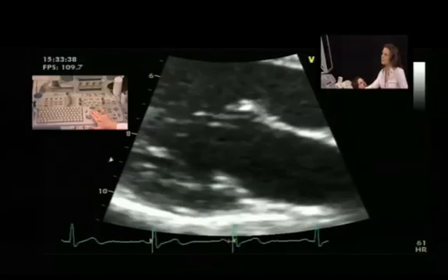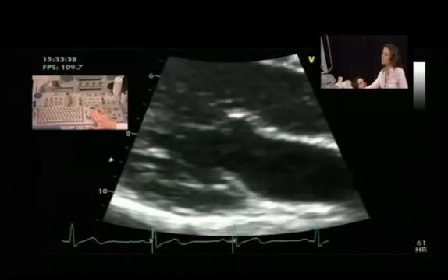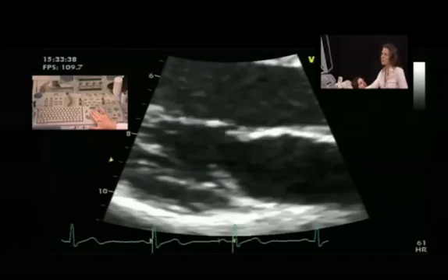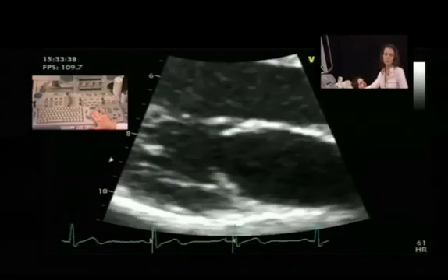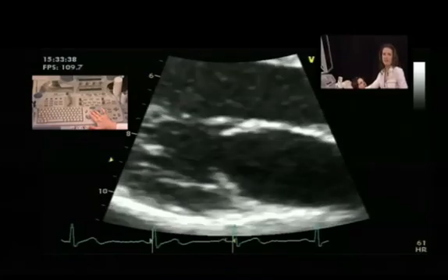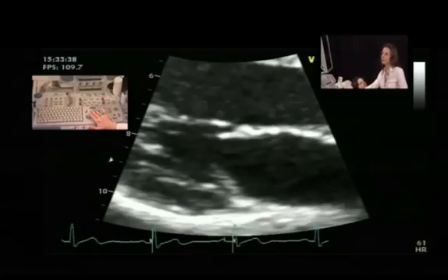You see here, for example, I'm interested in this part now, and then you can just scroll back and forth. This might be interesting in valve movement or when you have some endocarditis or something. Everything which moves very fast, it's very nice to have the high frame rates, and then in the review mode to go with slow motion or frame by frame.